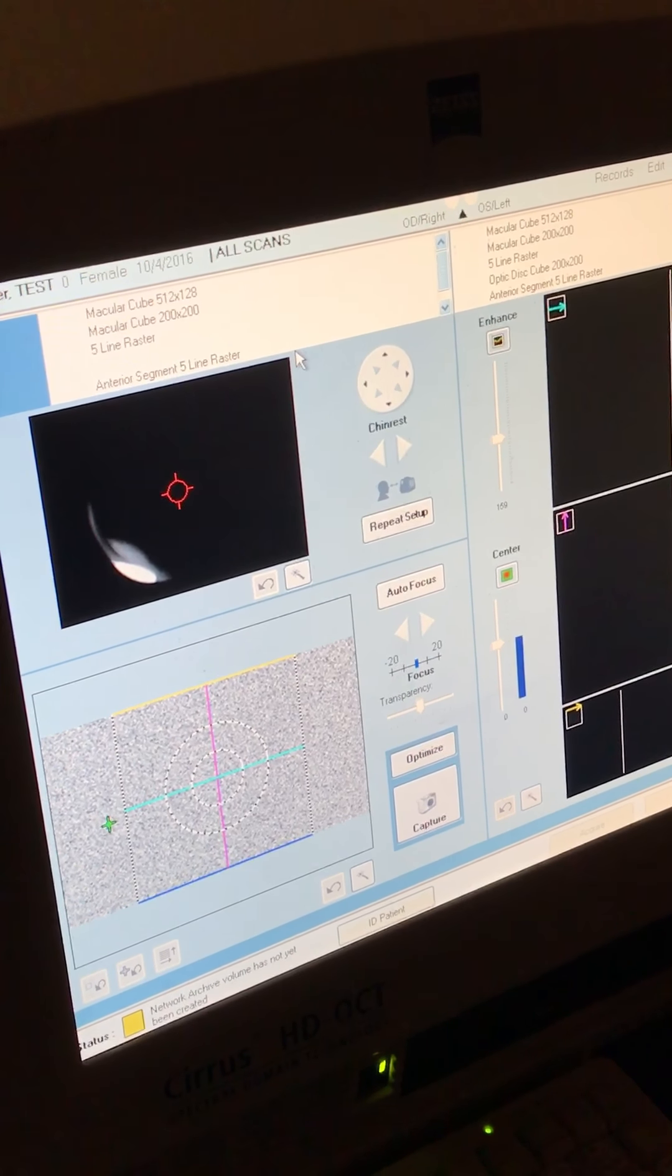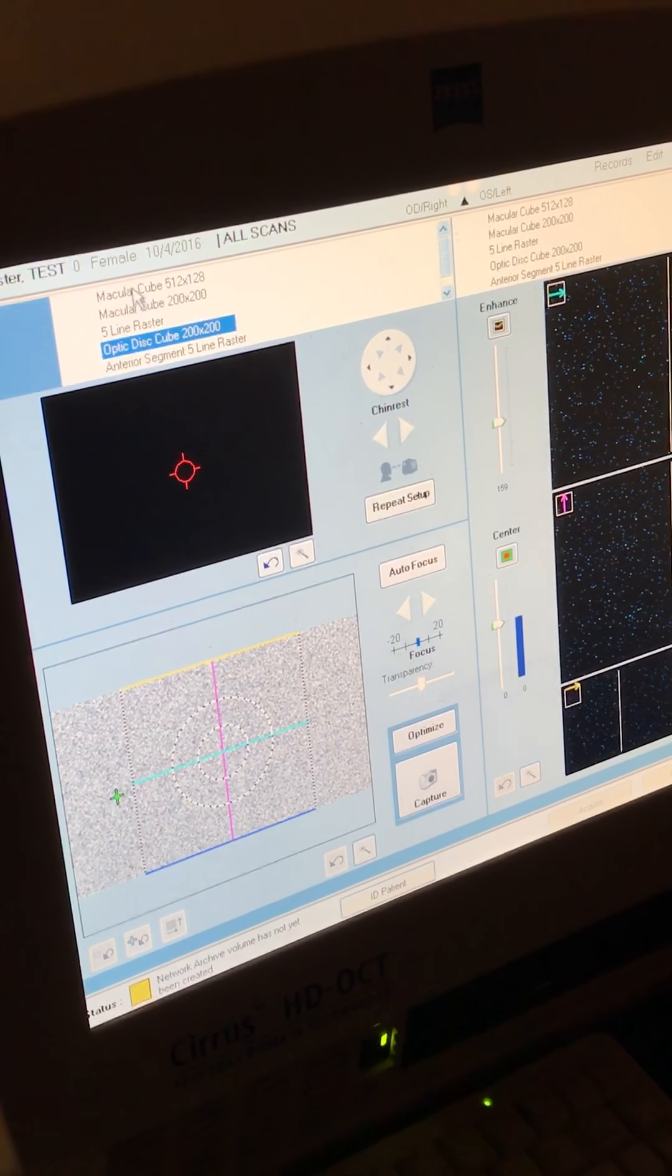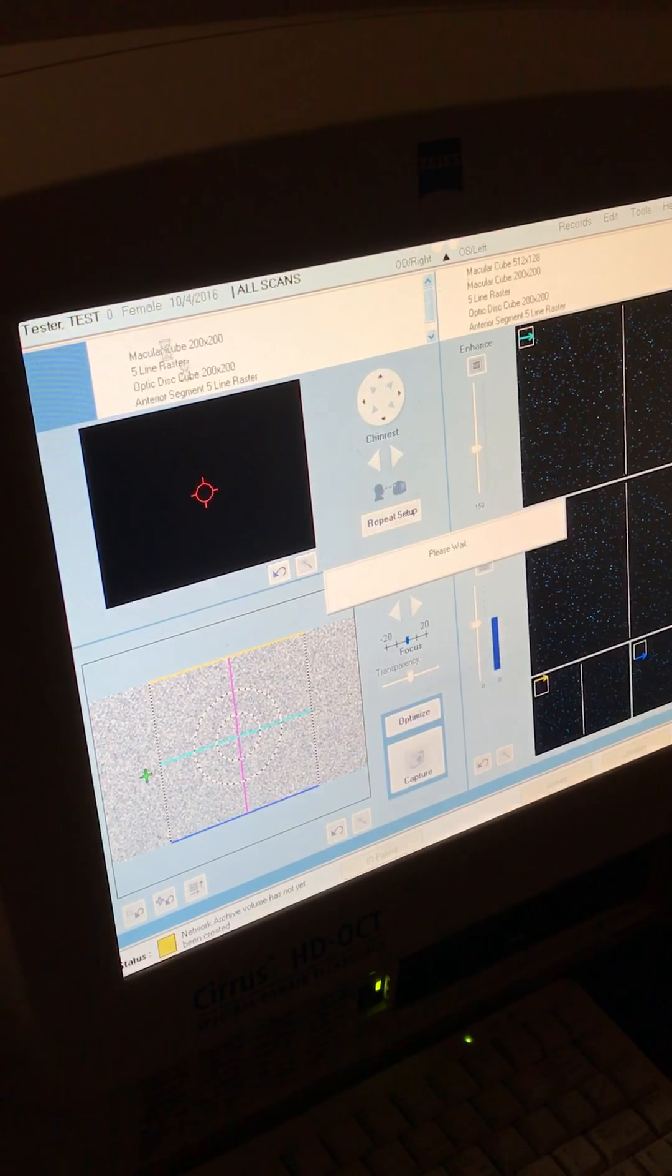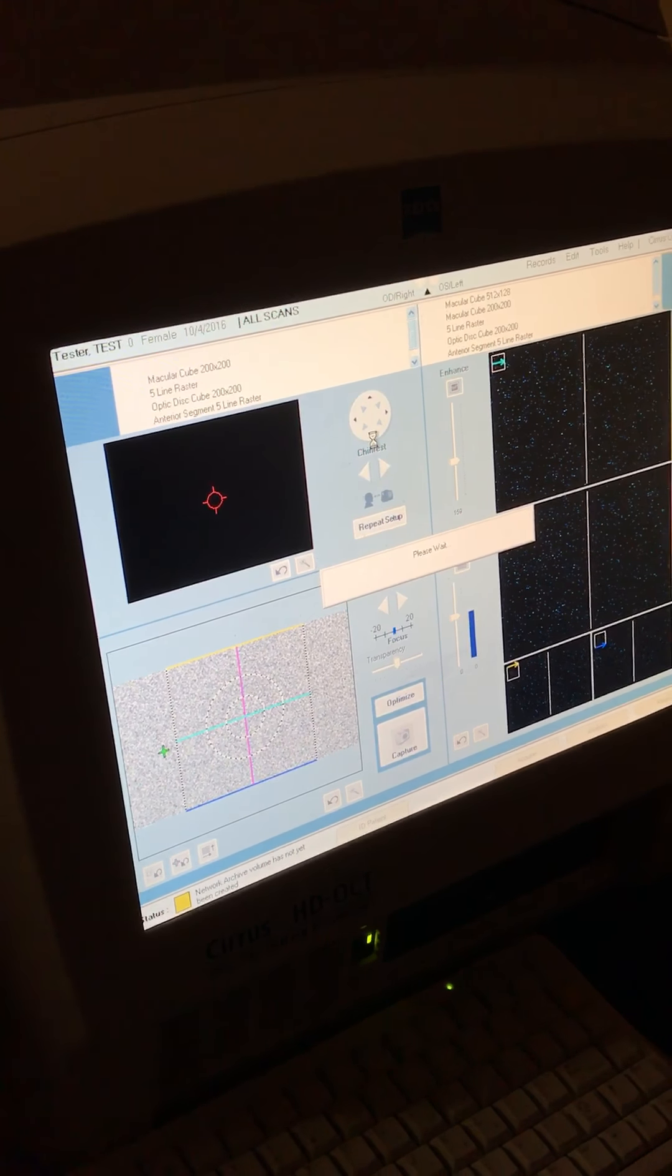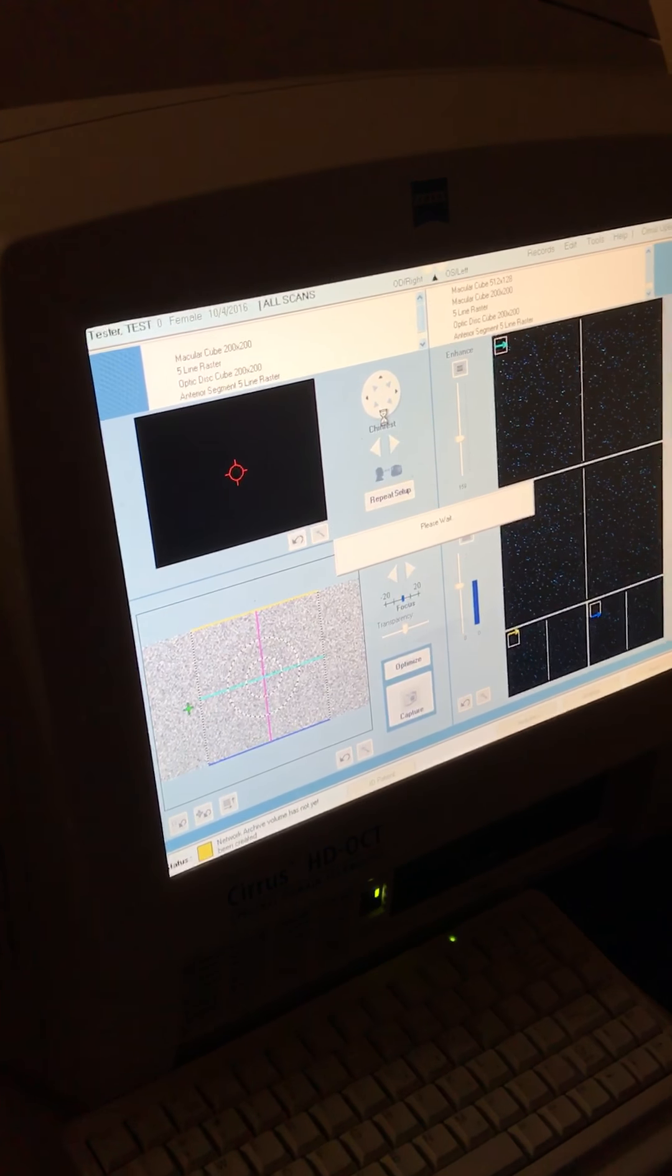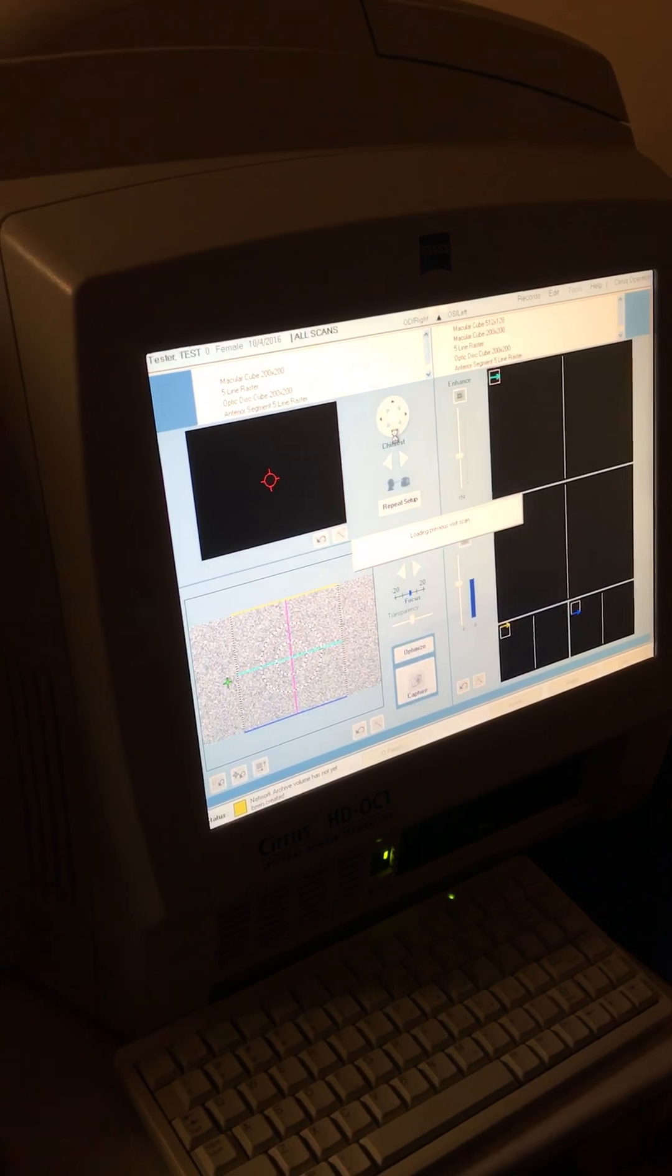So we'll do an OCTR to start, so I'll click on the macular cube and I'm going to raise this up for the patient.